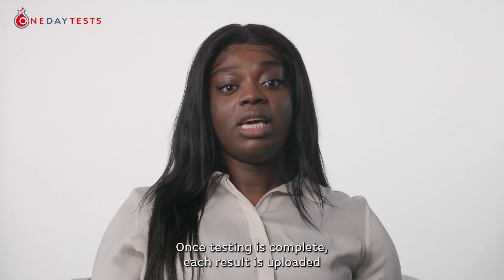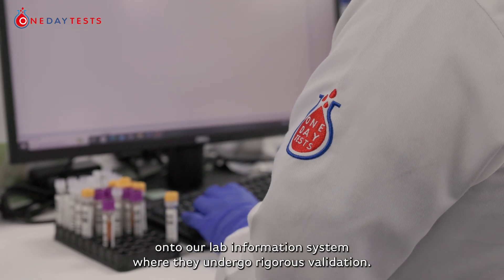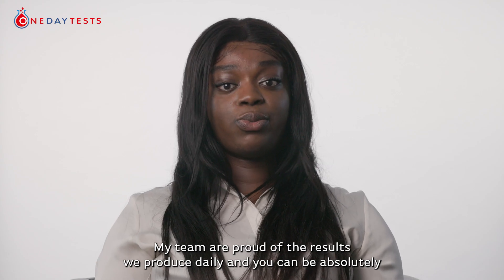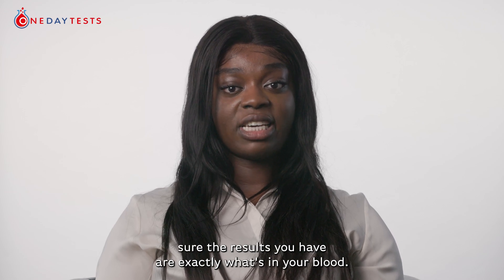Once testing is complete, each result is uploaded onto our lab information system where they undergo rigorous validation. When the tests are approved, these results are released to you. Our team are proud of the results we produce daily, and you can be absolutely sure the results you have are exactly what's in your blood.